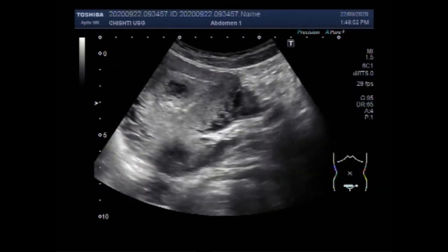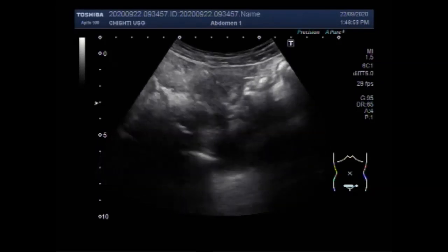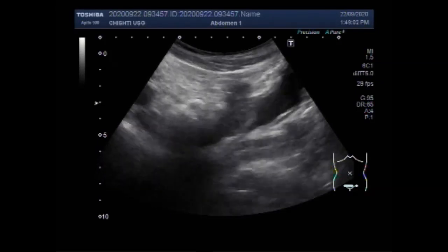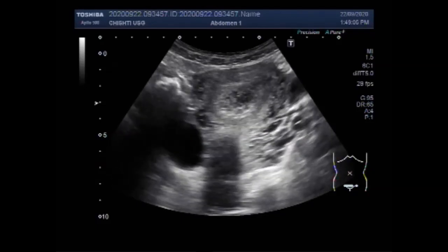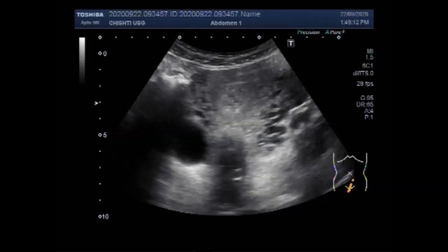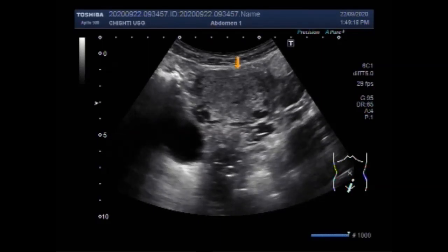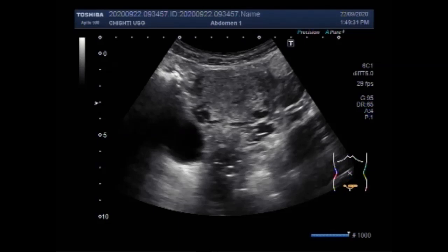Now again you can see the uterus. And now you can see the ovarian cyst — this is the ovarian cyst, and this is the uterus.